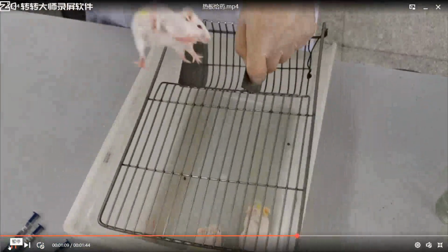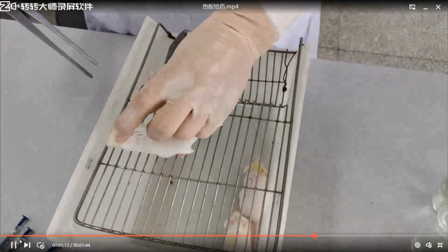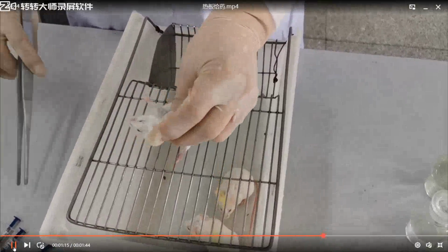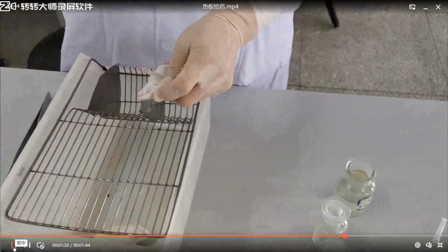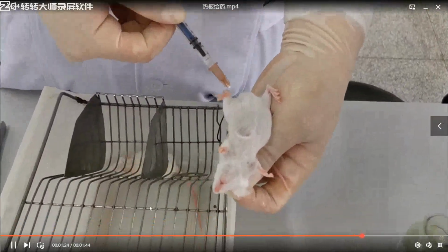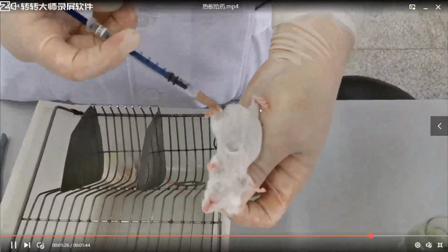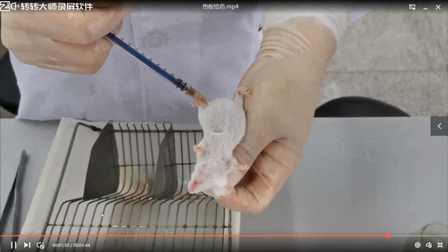This is the third one as the positive control group. So we will inject morphine intraperitoneally. Okay, we have prepared the morphine. Also use intraperitoneal injection, lower abdominal cavity near the middle line, and inject the drugs.